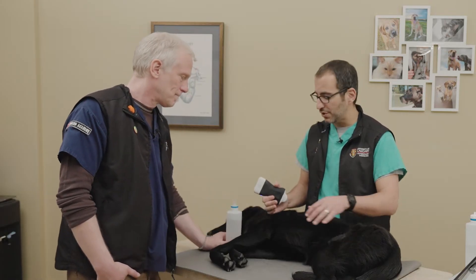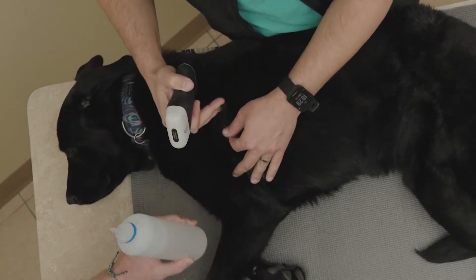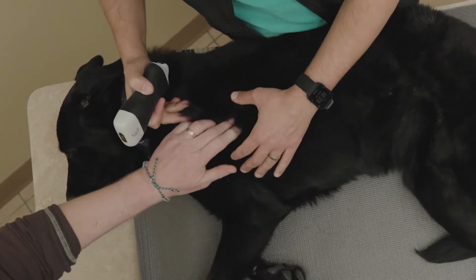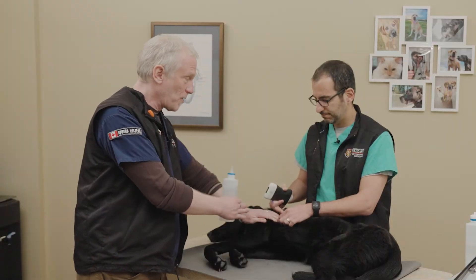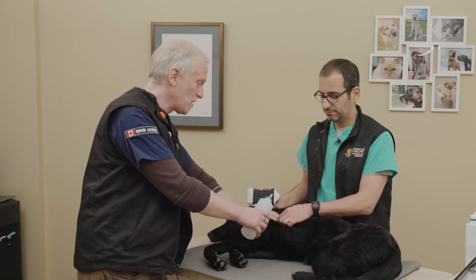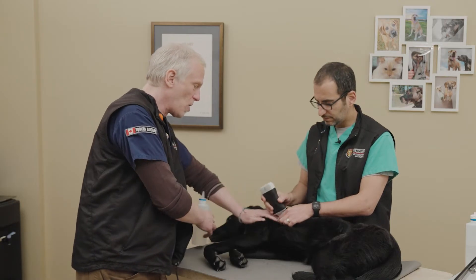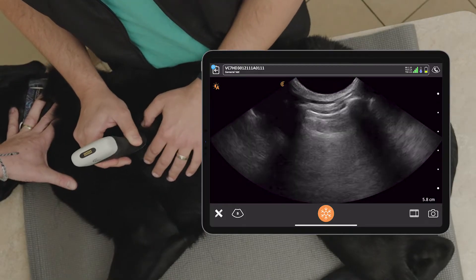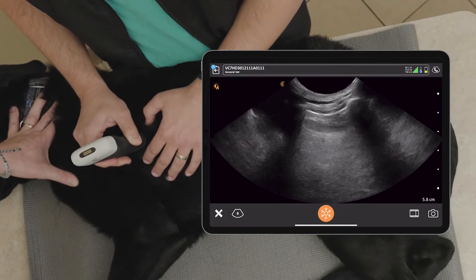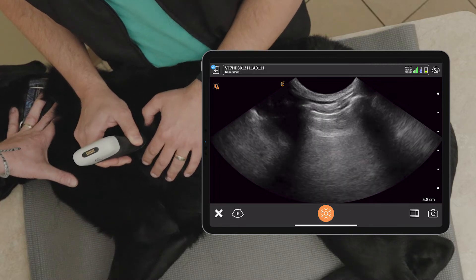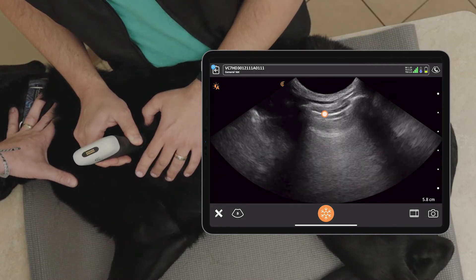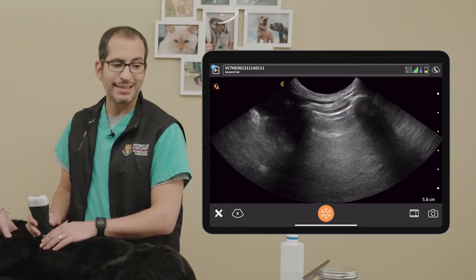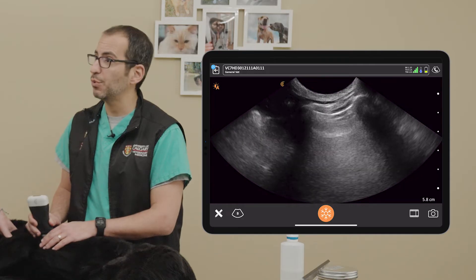We're going to pretend Penny is in sternal or standing for the sake of the demonstration. I like to start behind the cranial border so that we're sure we're over lungs. I'll get some alcohol there, part the fur, and pull the skin a little bit cranial and ventral so we can use fewer applications of alcohol during our scan. With the probe at the cranial border — limited by that forelimb — I'm looking for the bat sign, and there's the pleural line. I can immediately see that shimmer, so we have lung sliding at this point.